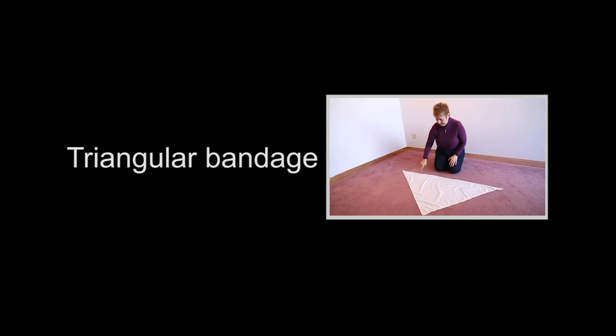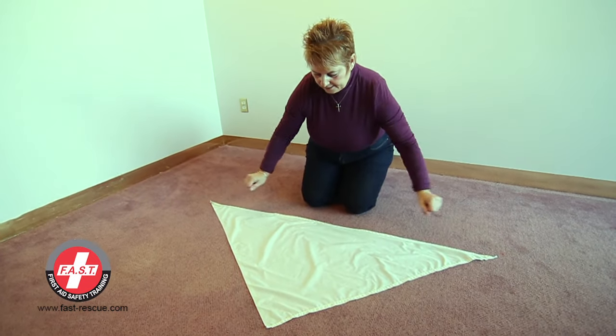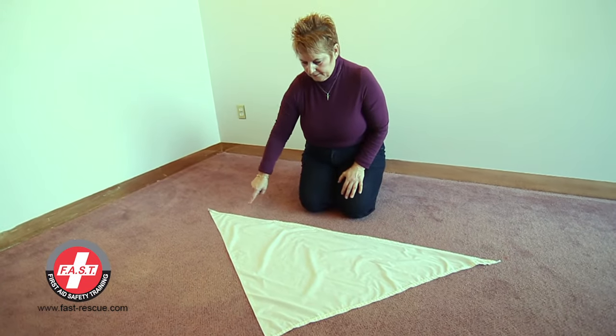Watch the video and we'll show you how to use this bandage. With the open cloth you have a point, two ends, and a base.